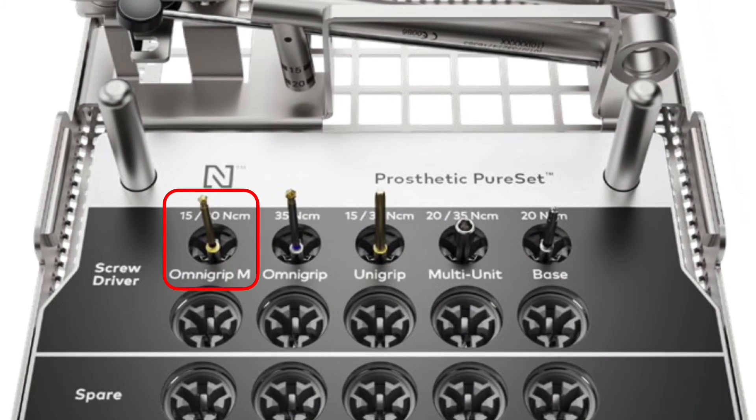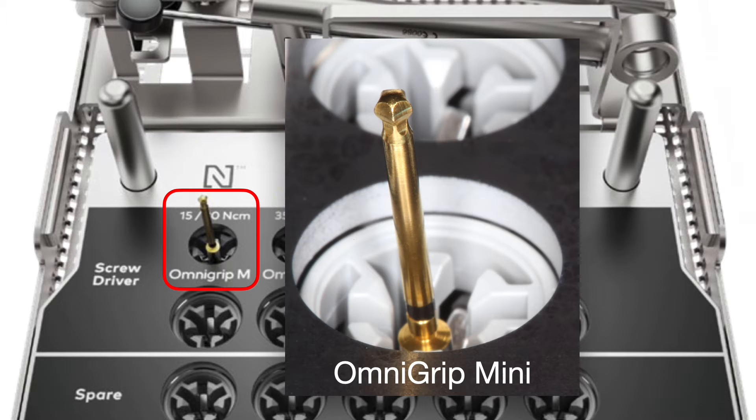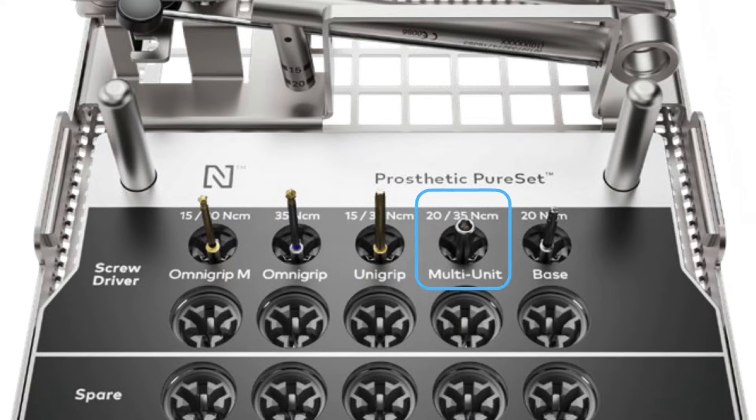Now looking at the OmniGrip Mini, it's on the kit shown here in the red. You can see this is a gold driver with a black line on it. It looks very close to the OmniGrip screwdriver, but this is an OmniGrip Mini so you're able to make a smaller screw. It's mostly used for prosthetics.